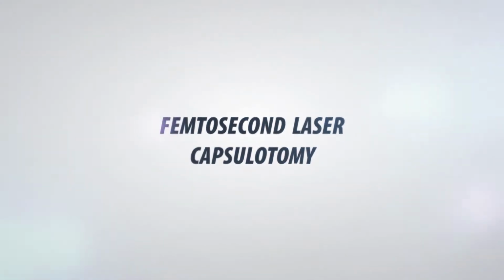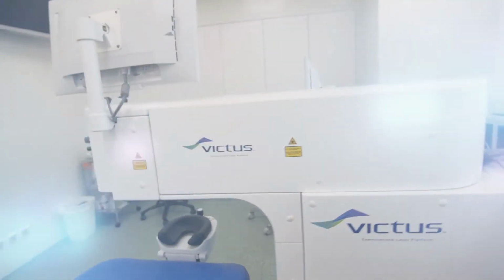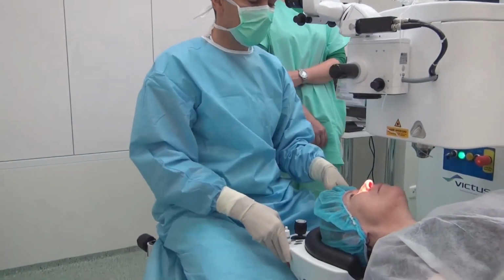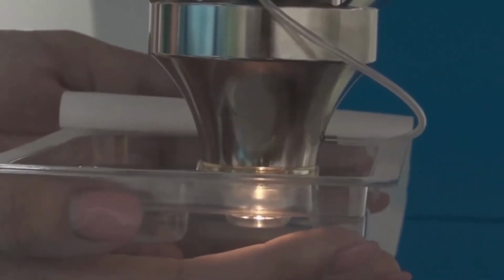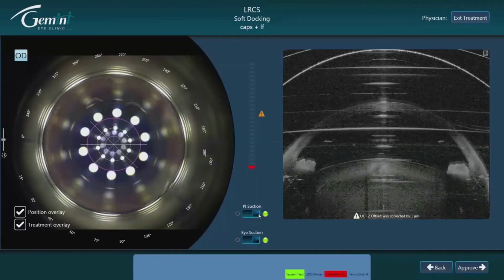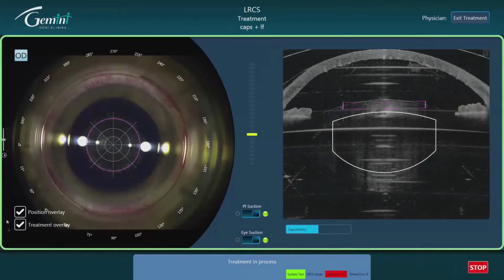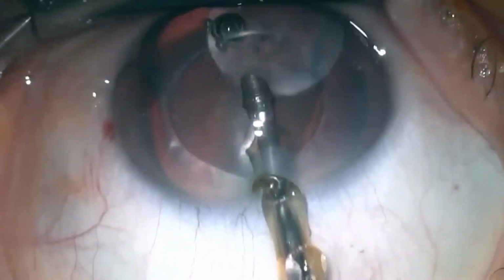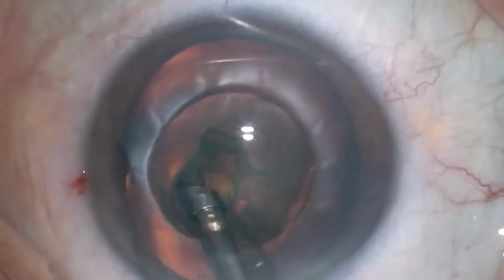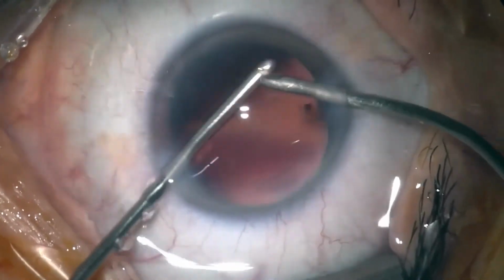Capsulotomy can be performed by laser with the promise of high precision. Current femtosecond lasers are bulky and expensive and usually require a dedicated operating room with strict air conditioning control and additional patient manipulation. Femtolasers require a firm connection between the eye and the laser, achieved by a process called docking. Femtolasers cut the capsule with high precision and produce so-called free-floating capsulotomies. But the cost and time are a burden, preventing a wider spread of this laser technology.